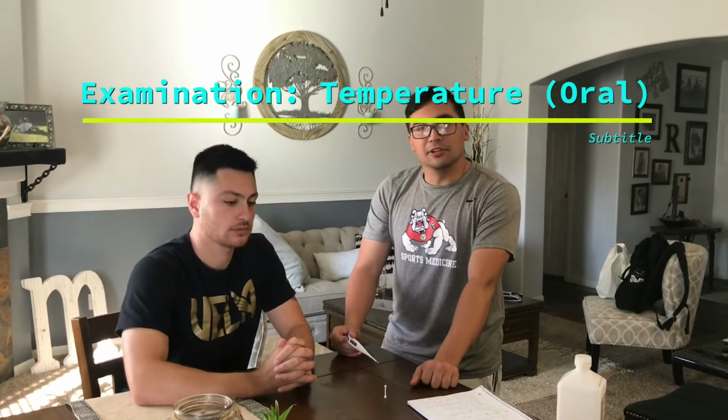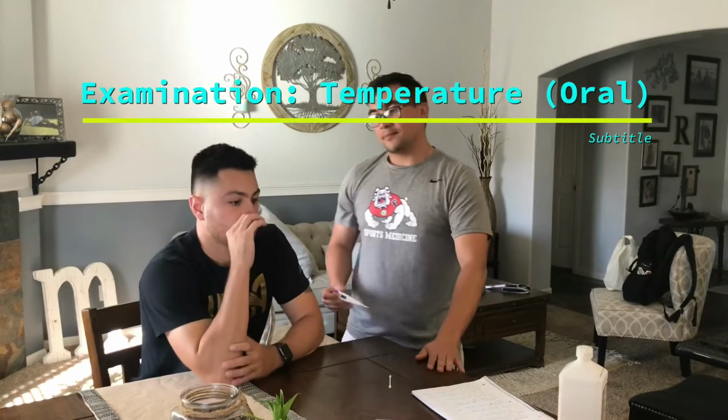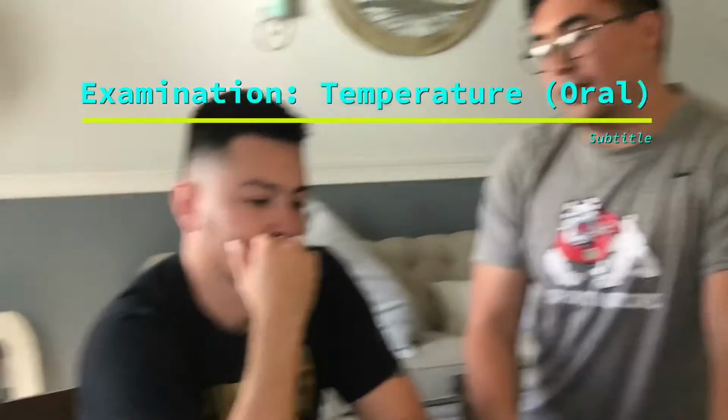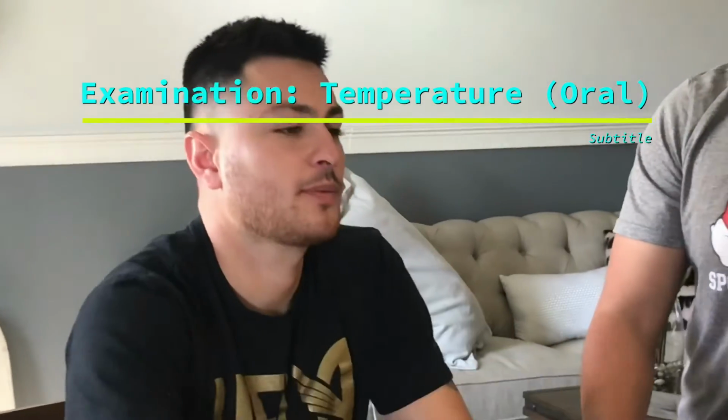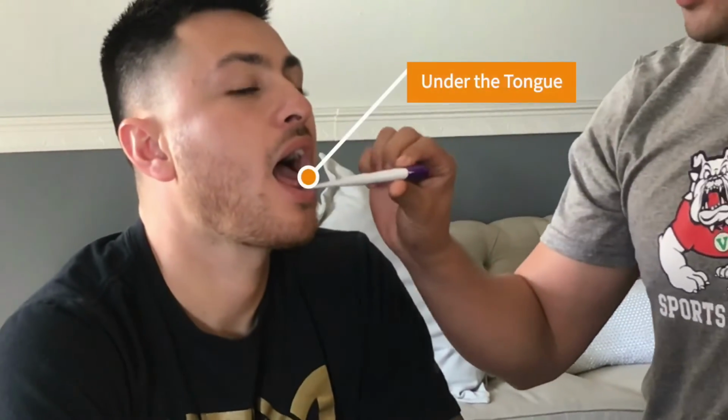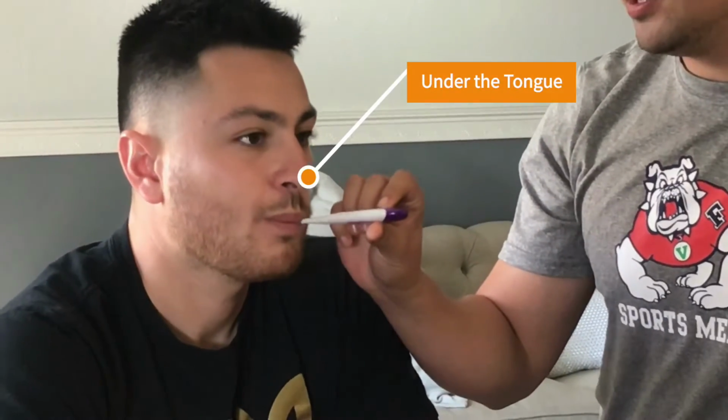All right, so I'm going to be doing an oral temperature here of Michael. To start off this exam, I'm going to need Michael to open up his mouth. And I'm going to put this right under his tongue. He's going to close it down. And I'm just going to click this button. And I'm going to wait until it either beeps or for about a minute. So right now we just wait.